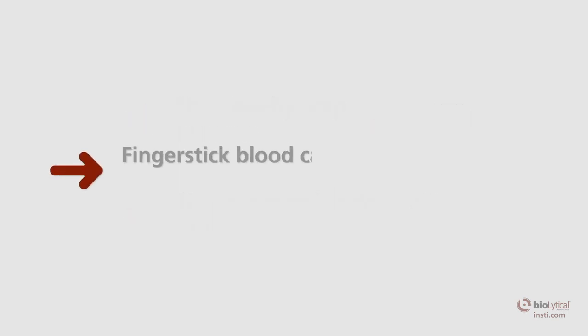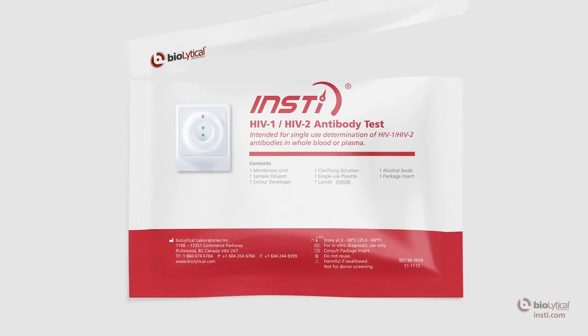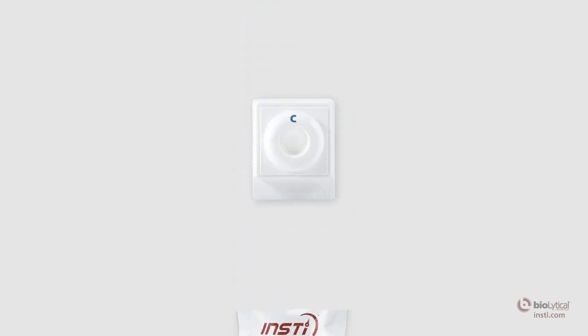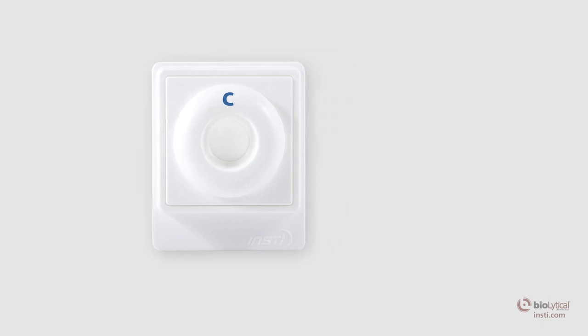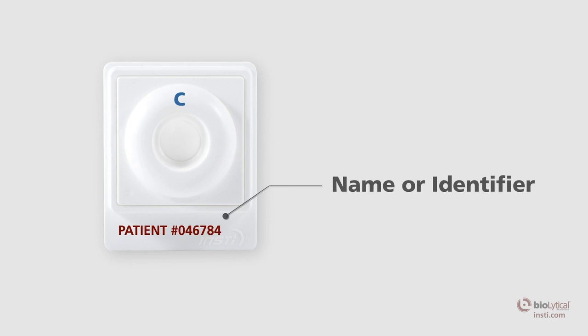Whole blood specimens collected by finger stick should be tested immediately. Open the INSTE package and remove all contents from the pouch. Tear open the membrane unit pouch at the pre-cut edge and carefully remove the membrane unit without touching the center well. Place the membrane unit on a level surface, making sure the tab is oriented towards you. The tab may be labeled with the patient's name or identifier for sample identification purposes.